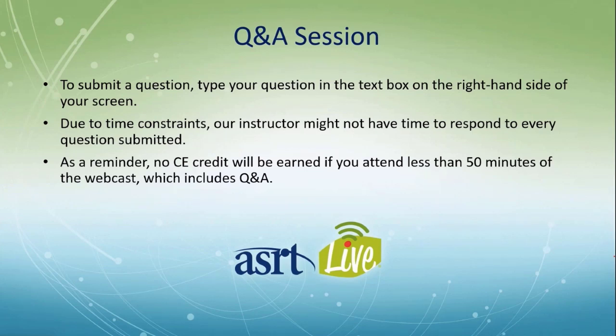But there's another important distinction to make between that and how sensitive the whole system is. This is really an important distinction. I call this pre-fogging. If you pre-fog a cassette out in the room before you use it, computers generally cannot compensate for that. And so you see these wonderful demonstrations that we show our students to avoid pre-fogging of detectors.